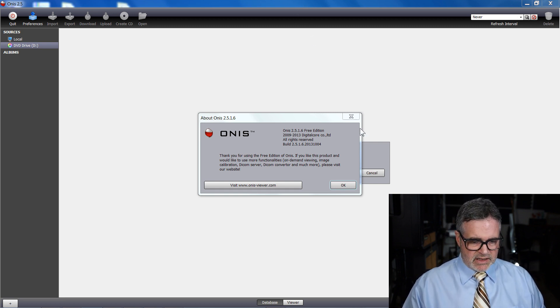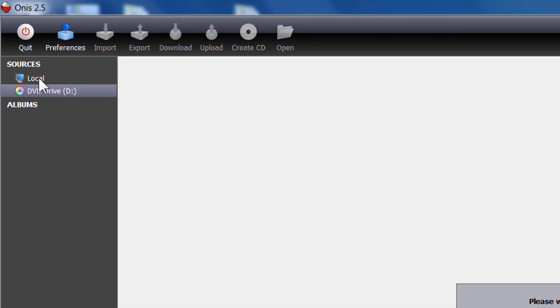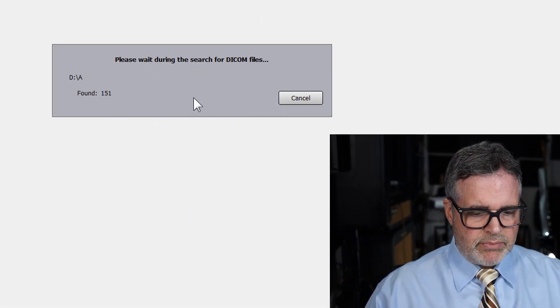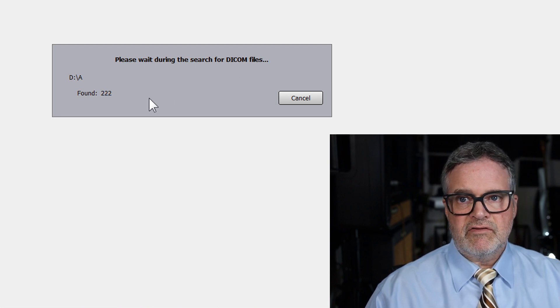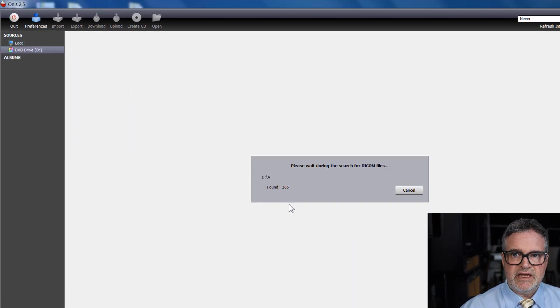Onus is loaded — click OK. Over here under 'Sources,' there are two sources. I could have downloaded the files onto my computer, which would be much faster, but I'll just keep it on the DVD drive. Go to the DVD drive and it will automatically search. Click OK for it to search, and now it's loading the DICOM files — there are about 500 of them.